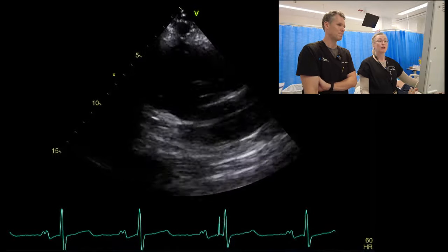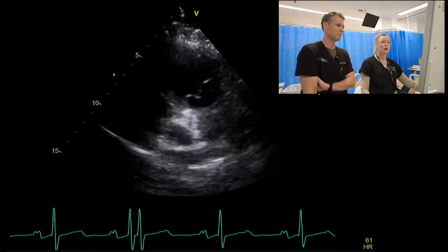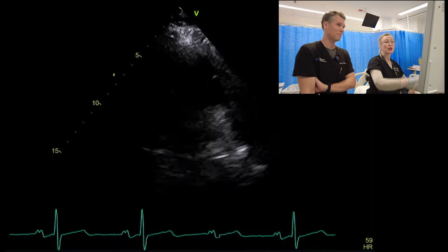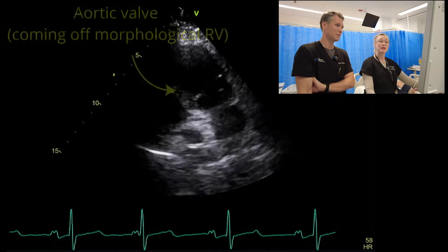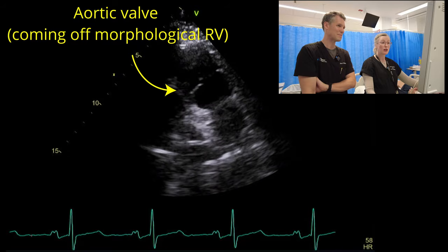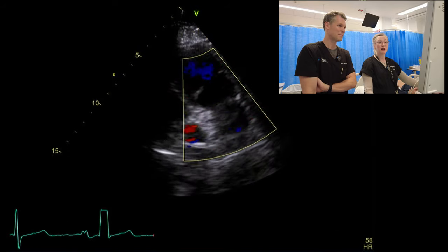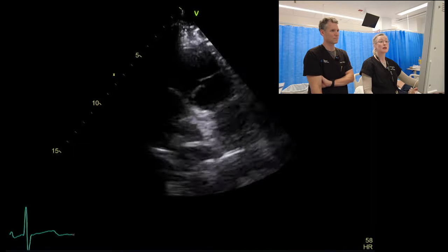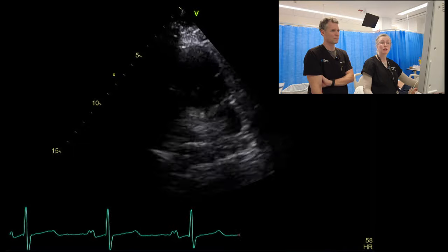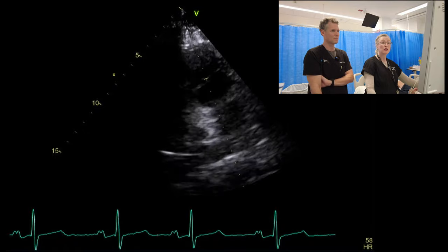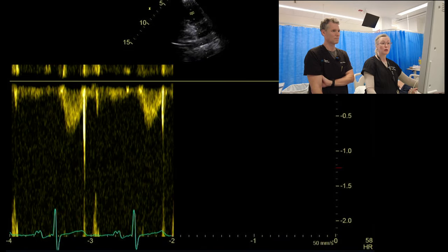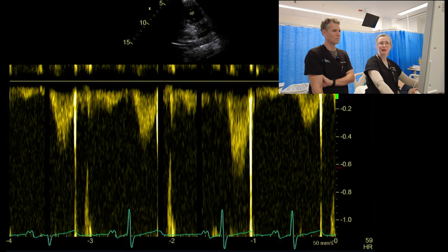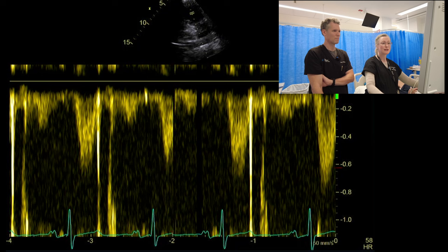Tilting up towards the systemic outflow, this is our aortic valve and aorta. We'll put colour through that looking for any significant regurgitation. We can assess estimated cardiac output through that, doing our usual things — cursor behind, pulse wave Doppler. What we would normally measure here includes acceleration time, though that isn't really validated in this context because this is our systemic flow.